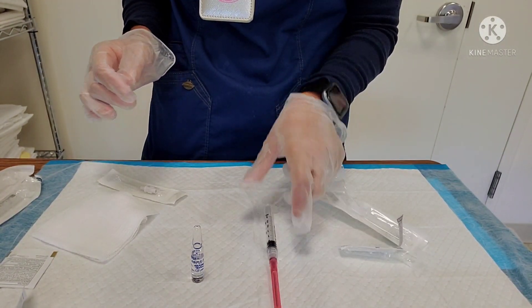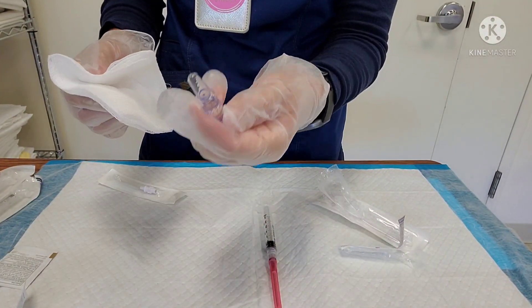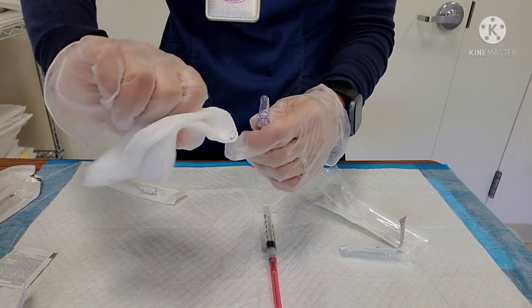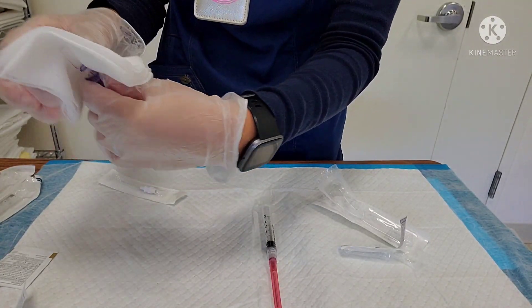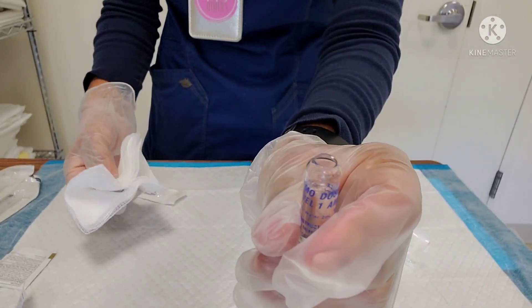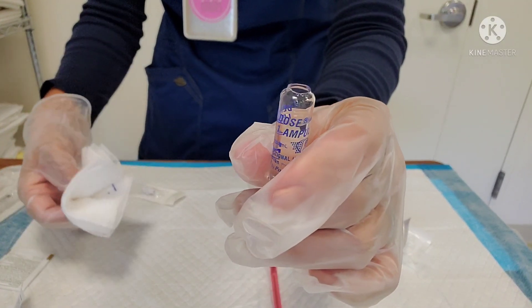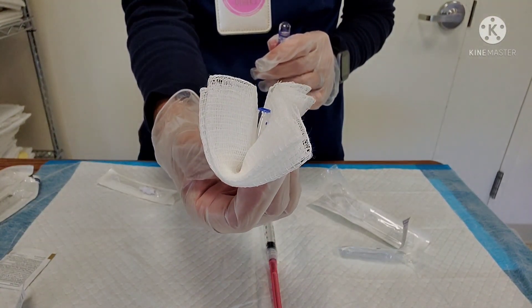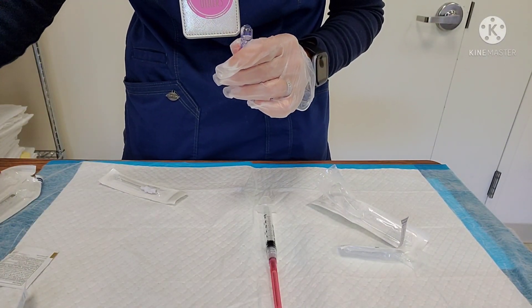I can put this down because it's covered. I'm going to grab my 4x4 gauze. There's this little dot there, so that's where I'm going to put my thumb, and very importantly, I'm going to snap the cap away from me — don't want to snap it towards you. Make sure that the cap is completely covered. So you heard that snap, and this actually broke pretty nicely. Sometimes these can break a little bit unevenly, but this one looks pretty good. Hopefully you said to put it in the sharps container — so I'm going to go ahead and put it in my sharps container because it is a sharp.